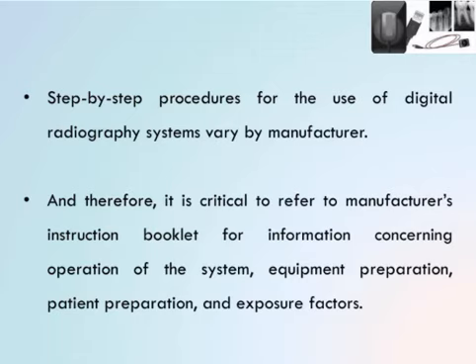Step by step procedures are required for the use of digital radiography, which differ from manufacturer to manufacturer. Therefore, it is critical to refer to the manufacturer's instruction booklet for information concerning the operating system, equipment preparation, patient preparation, and exposure factors.